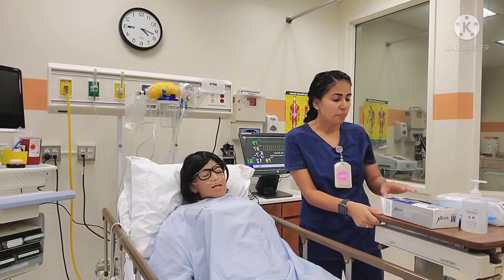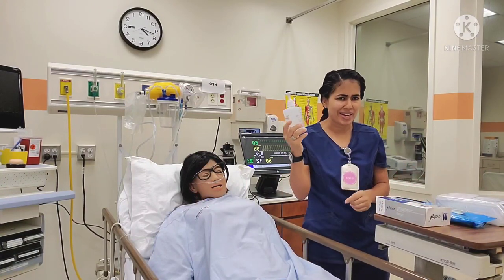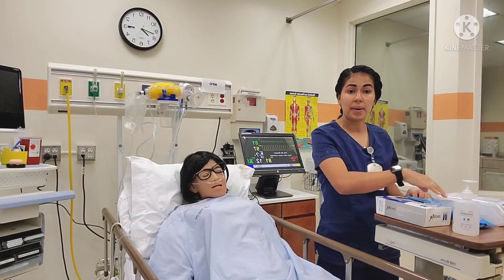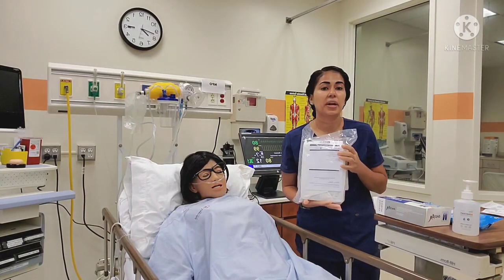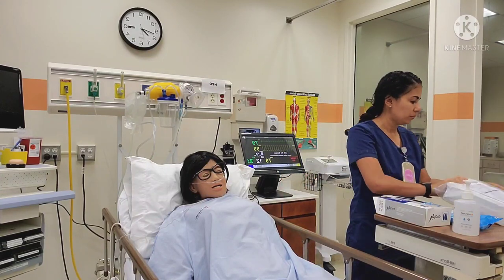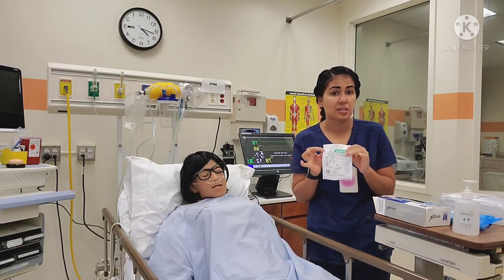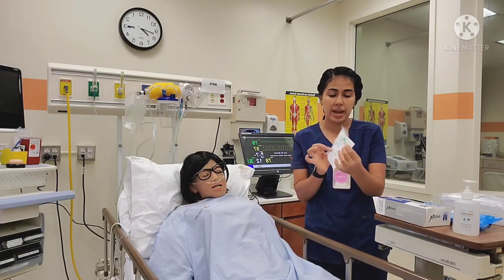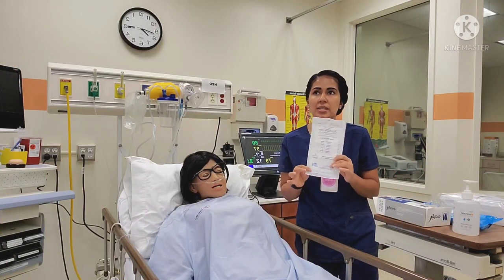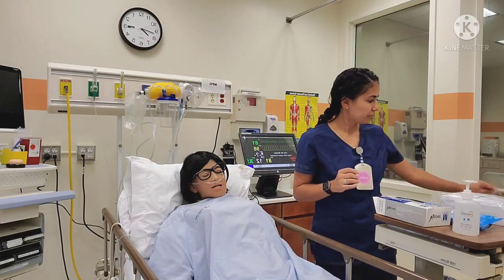For this procedure I'm going to need a set of regular clean gloves, hand sanitizer, some disposable washcloths to clean the perineum, my indwelling urinary catheter kit — this one is a 14 French. I also need a securing device to secure my catheter to the thigh once I'm done; today I have a stat lock. And I like to bring an extra set of gloves just in case my hands become contaminated so I don't have to run out of the room.